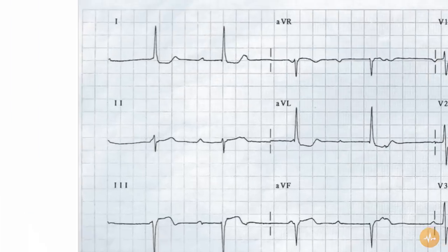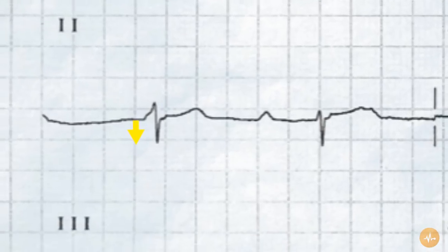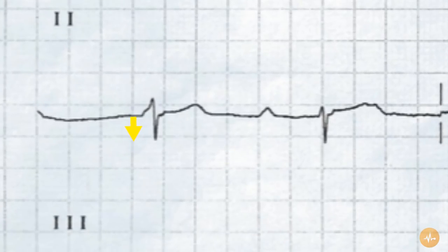The axis is left axis deviated, with an up-going complex in lead 1 and a down-going complex in lead 2. The QRS duration is at the border of long, measuring 3 small squares in duration.